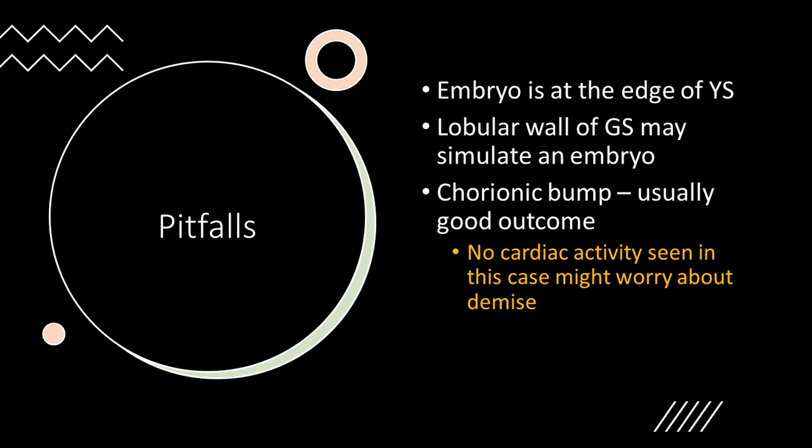So search for that embryo thoroughly. Take your time, search for it. After you find the embryo, take your time to search for the heartbeat. Take your time to examine the embryo and make sure that 100% you're not seeing the heartbeat.